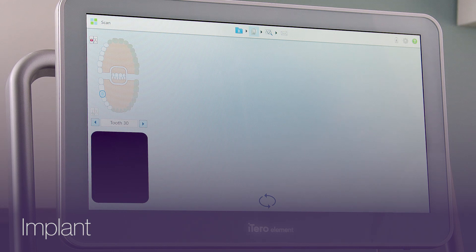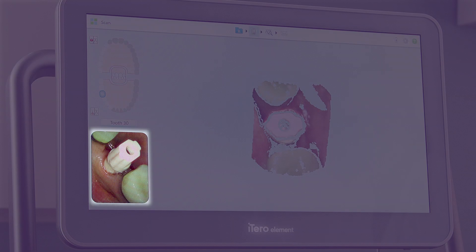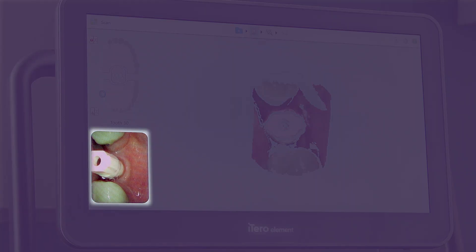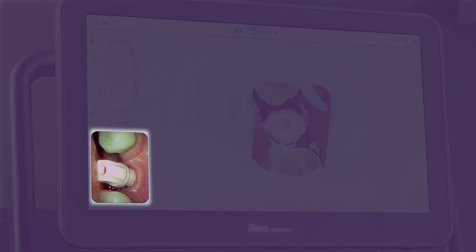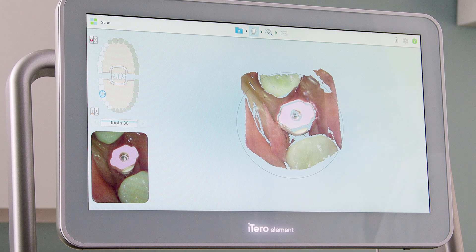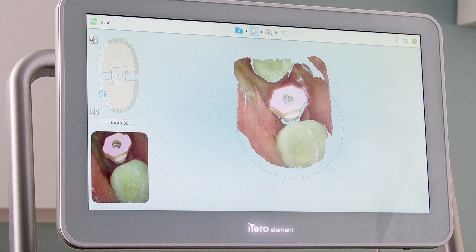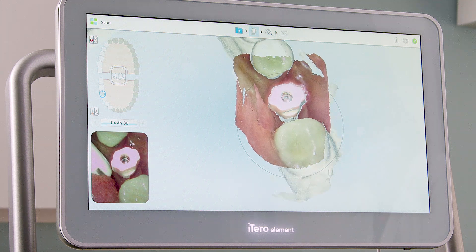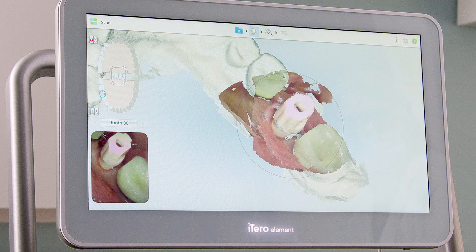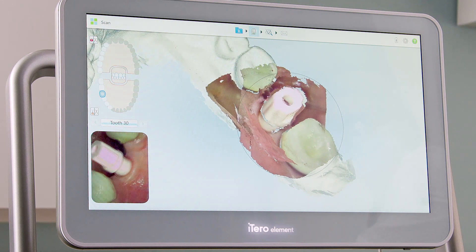I will capture the occlusal, lingual, and buccal of the implant scan body. It is important that the implant area is dry and that I capture all the surfaces of the scan body: occlusal, lingual, buccal, mesial, and distal.